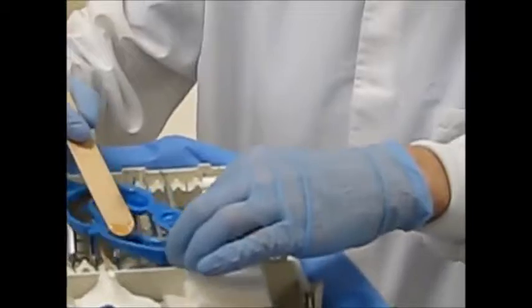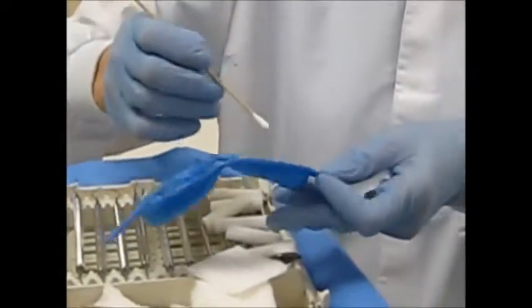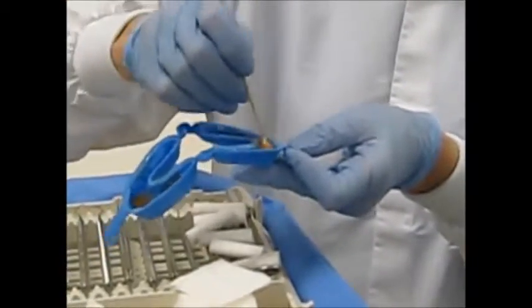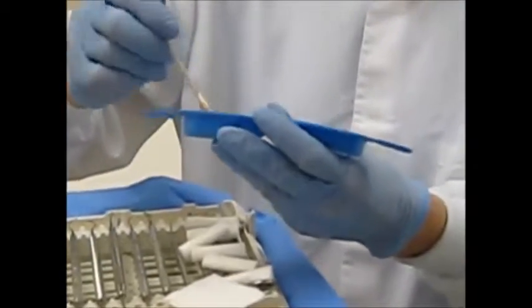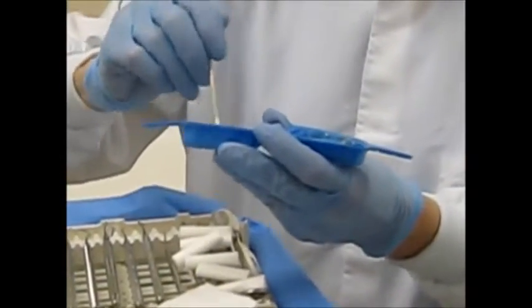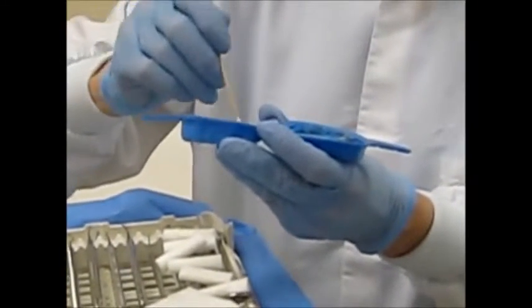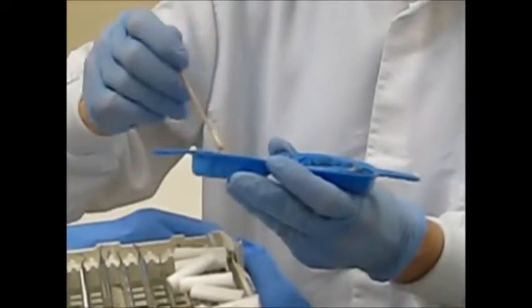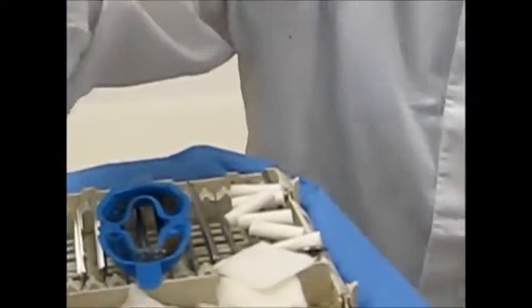So I'm going to divide the fluoride up equally, take a cotton swab, and just evenly distribute that fluoride into each tray on the maxilla and the mandible. As I'm doing that, I want to begin to discuss with the patient some of the instructions that I would provide for this fluoride treatment. The tray is ready, cotton swab into biohazard.